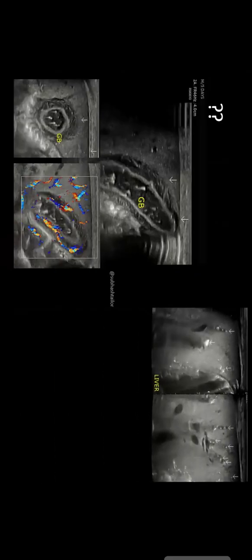Now see, what is this? This is a 5-day-old premature neonate. This is a gallbladder scan showing gallbladder wall edema, thickening, halo, internal echoes, sludge, some cholesterol crystals showing comet-tail artifacts, right? Hyperemia of the gallbladder wall, that is inflammatory.